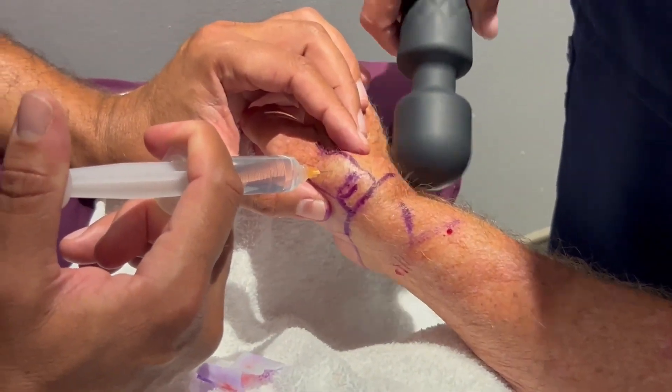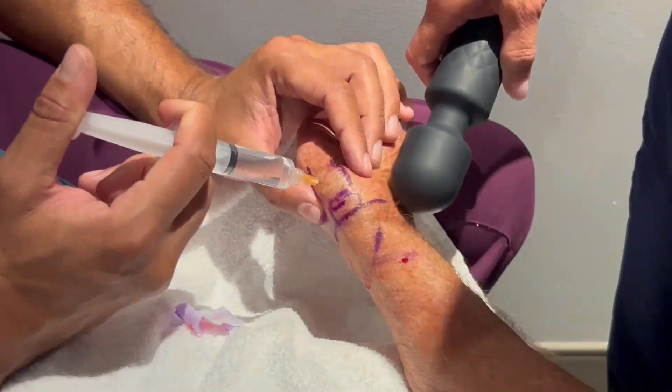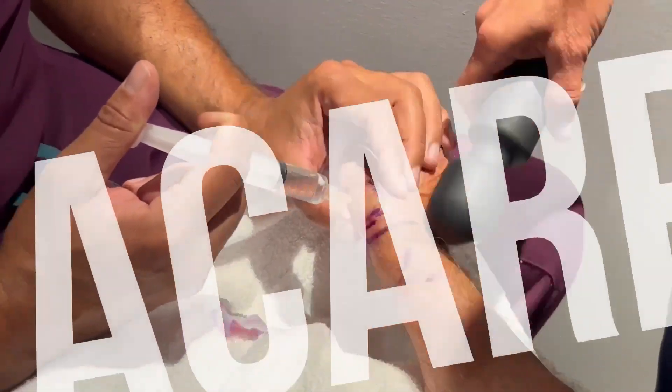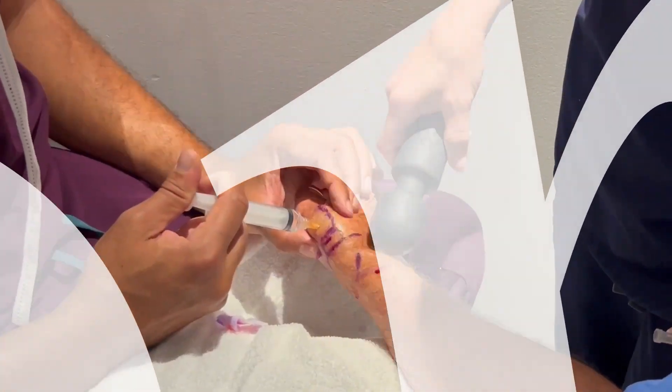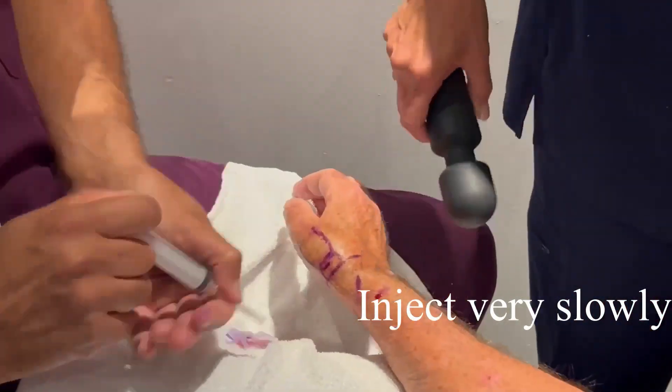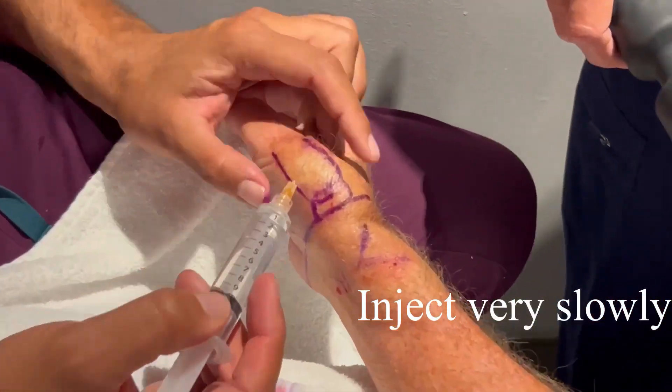Then we're going to do the same thing over the middle aspect of the metacarpal bone, all the way down to the periosteum. This injection is done very slowly.